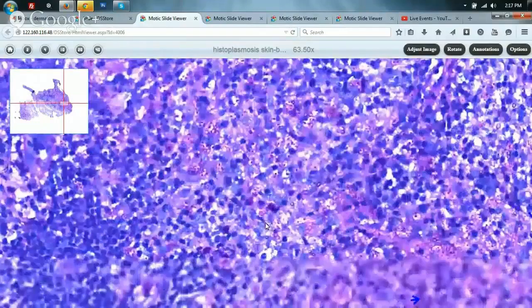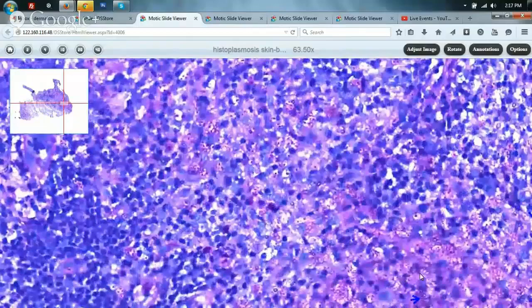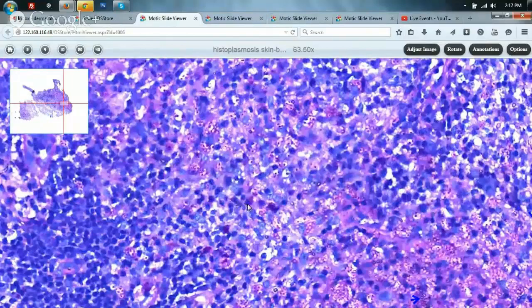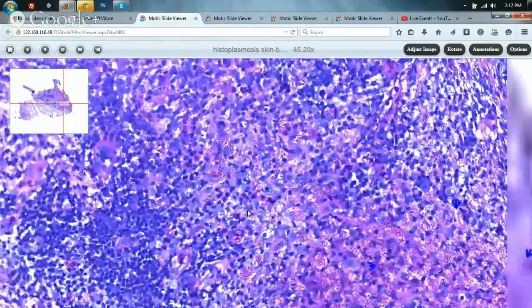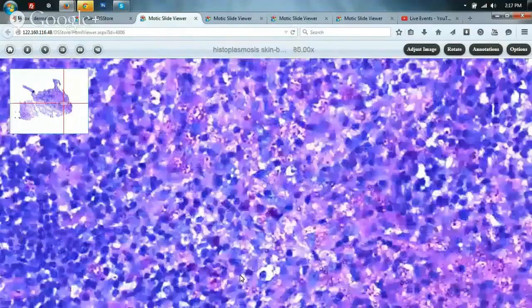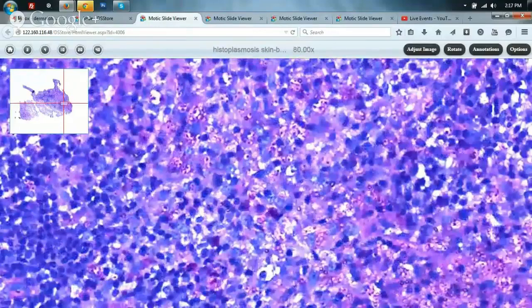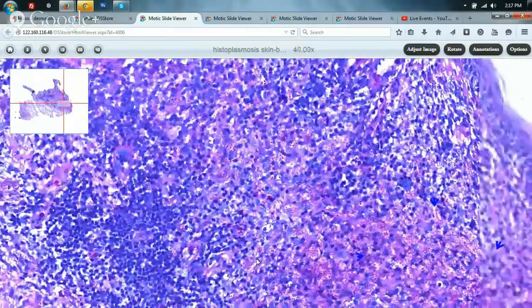Based on this one can also send for cultures. These yeast-like organisms lie within a pseudo-capsule. Unlike cryptococcus — which can also present as a yeast but is much larger than histoplasma and has a true mucoid capsule — both a larger size and true capsule are lacking in histoplasmosis, which helps us come to a conclusion about the diagnosis.